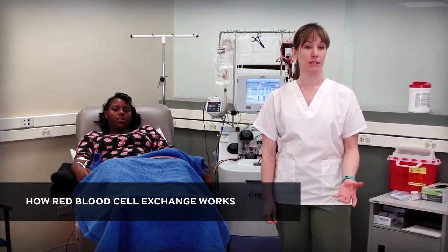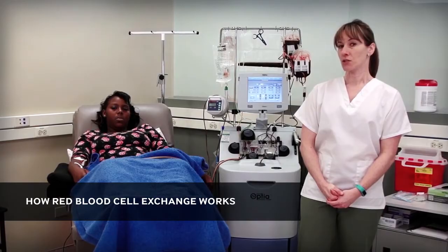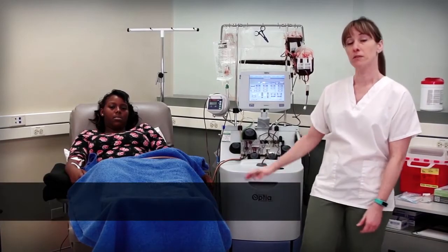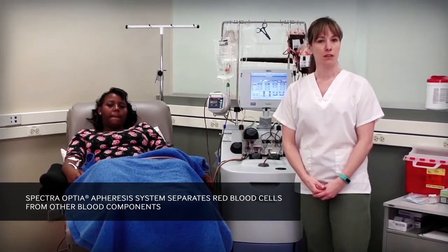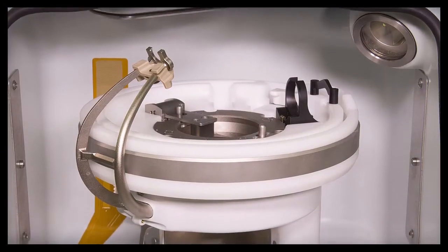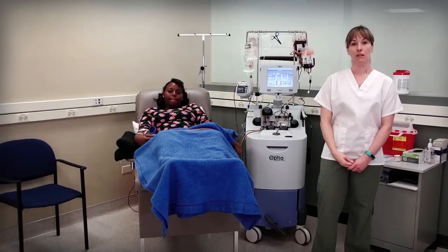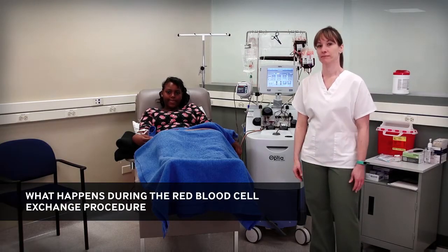Now that we understand how sickle cell disease affects the red blood cells, let's explore how red blood cell exchange works. The red blood cell exchange procedure uses a medical device called a blood cell separator, for example, the Spectra Optia Apheresis System. The system uses a centrifuge that spins blood and separates it into red blood cells and other blood components. Now, let's take a look at what happens during a red blood cell exchange procedure.